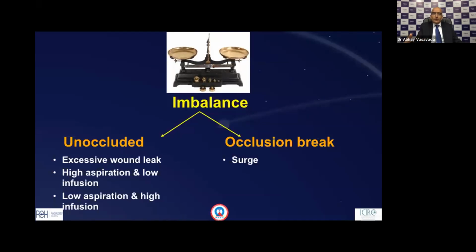But even in an unoccluded state, when there is no occlusion, we need to be careful to avoid excessive wound leak, with tight, good incisions.